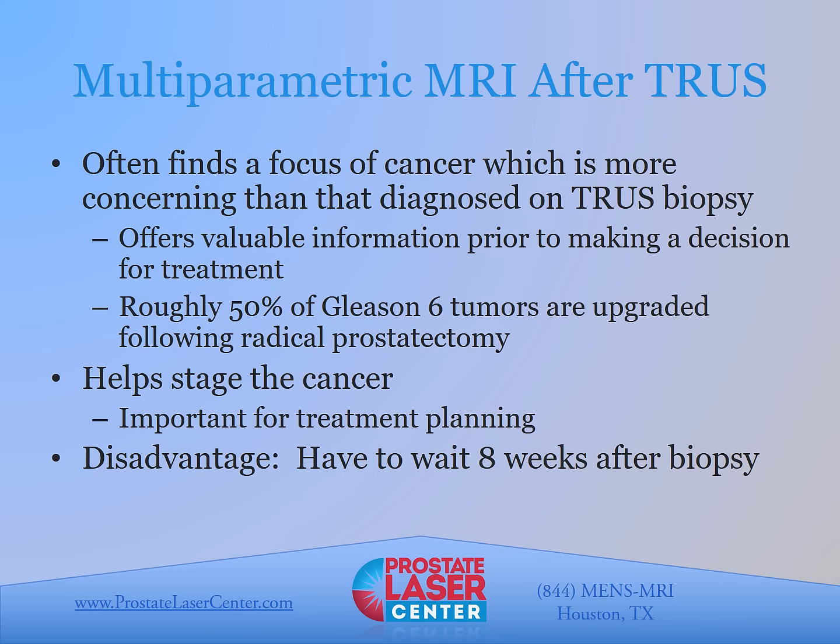Patients will oftentimes get a CT scan, which offers minimal benefit. A prostate MRI has tremendous sensitivity for extracapsular extension, especially when compared to a CT scan, and that has real implications for treatment planning. Now, the disadvantage of doing the MRI after the TRUS biopsy is that one must wait 8 weeks after the biopsy, and the reason for this is that the biopsy causes hemorrhage changes in the prostate, which can cause significant distortion and artifact.